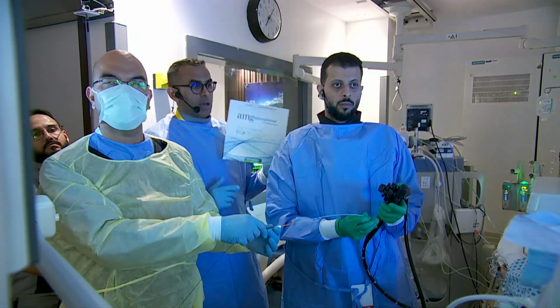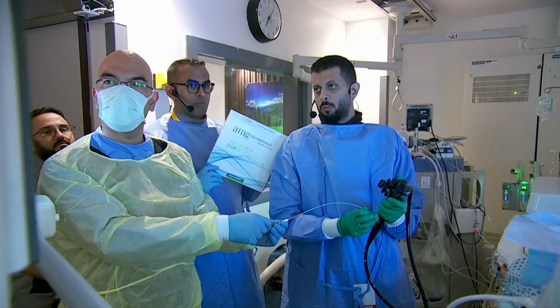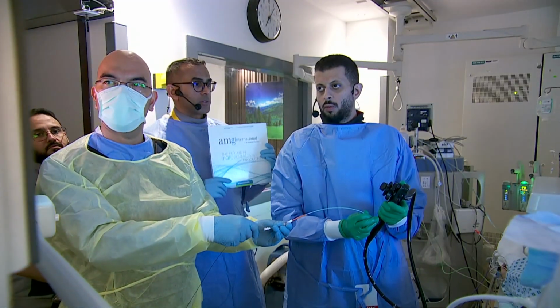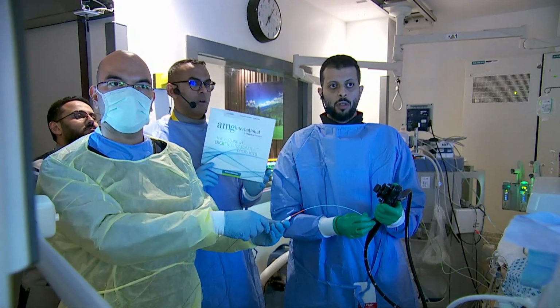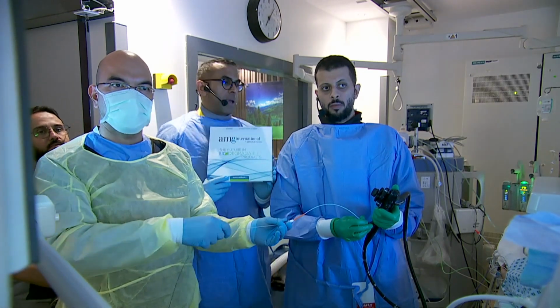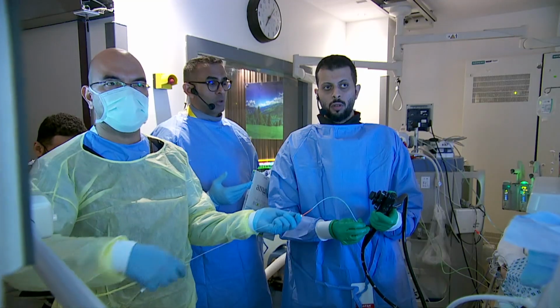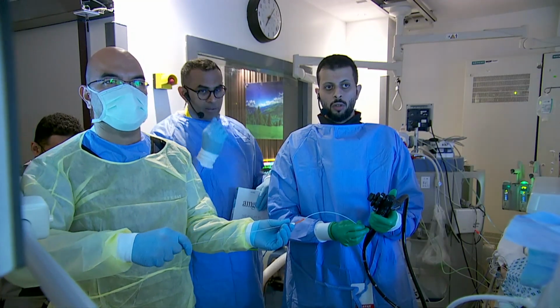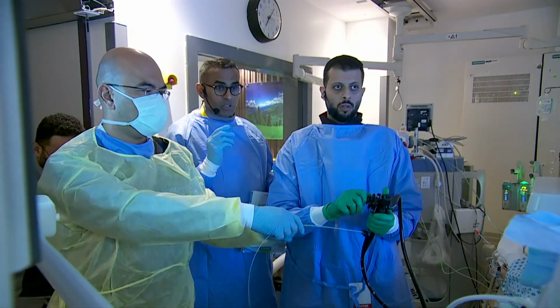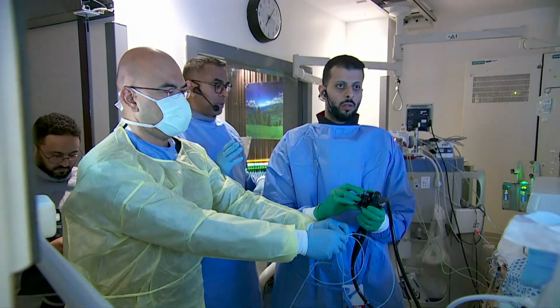ERCP. So the biodegradable stents are one of the options that we can consider. They are self-dissolving stents that can be introduced to biliary strictures, or you can have stones or pancreatic strictures. The feature about this stent is that you can just place them and forget about them, as they completely dissolve in a matter of weeks.